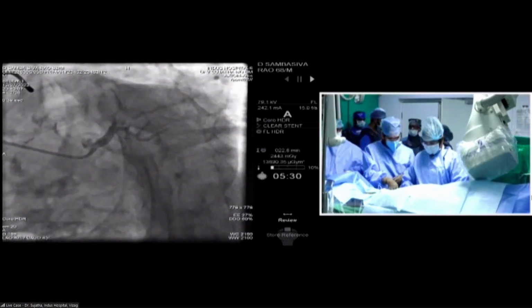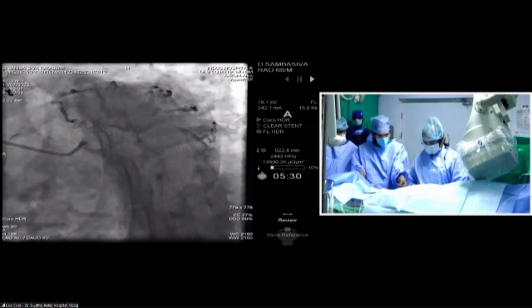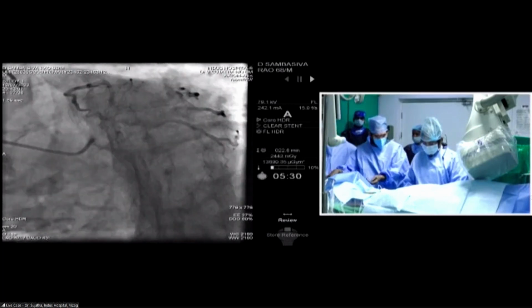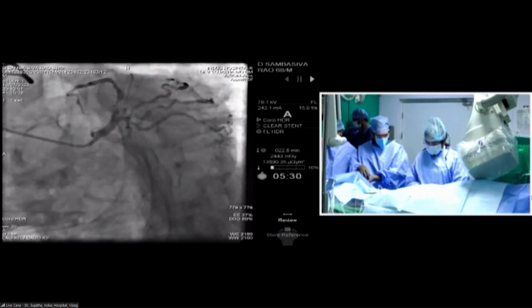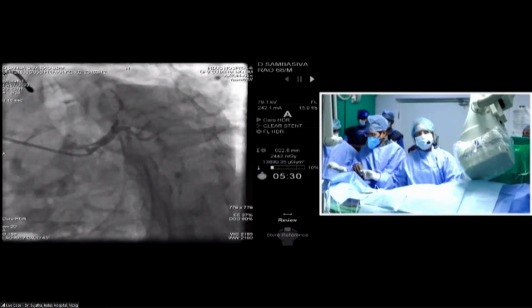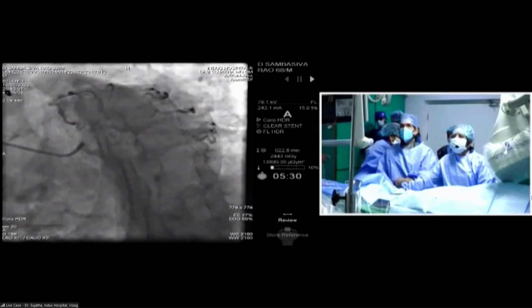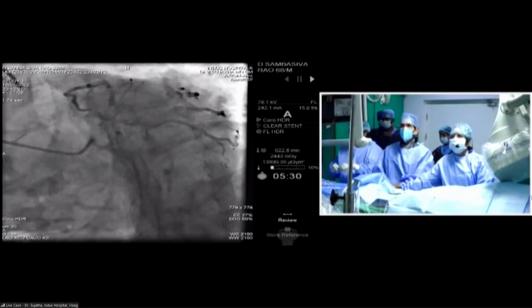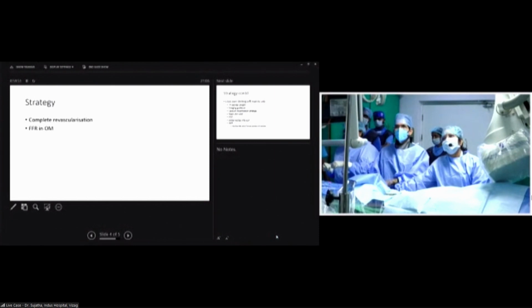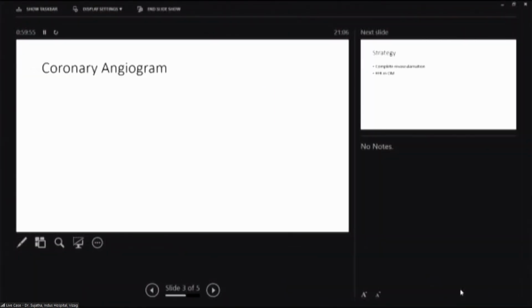Okay. Basically, madam, if you have a doubt of stenosis severity, then you think of FFR, be it ACS or chronic, no? Here, I think lesions look pretty tight. LAD is definitely tight. Distal LCX also looks tight. So madam is asking about OMs, I think. Whether OM... Yeah, I'm asking about OM1 and OM2. So what would your approach be? They feel it looks tighter, they're saying.